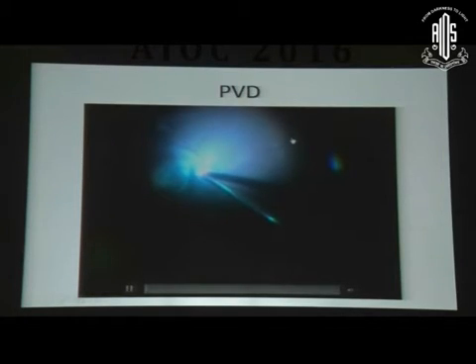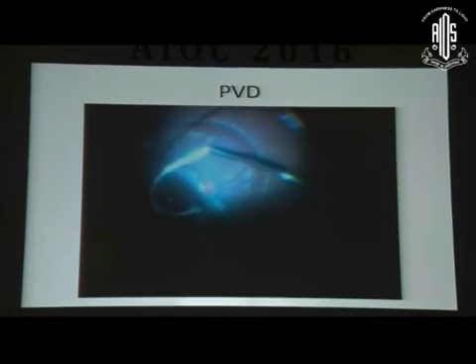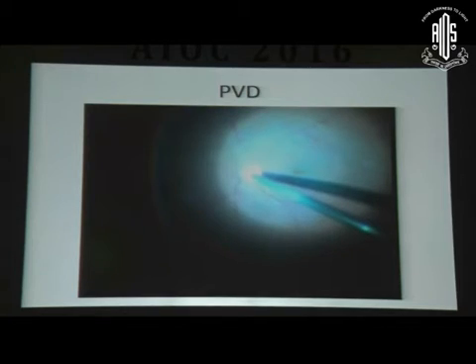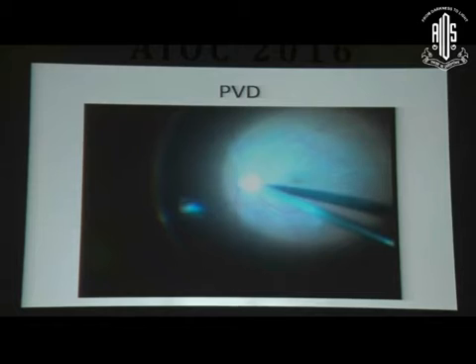And this is a small video that shows the importance of the PVD, because in all these patients the problem is because of the attached vitreous. So you have to be thorough in the vitreous removal. A gentle PVD is a must. You can stain the vitreous and do the PVD. And you have to always look at the periphery. In this case, the vitreous was very taut, and you can see the folds occurring when you are trying to engage the vitreous. The PVD is being induced.